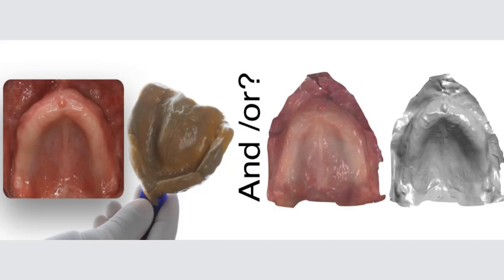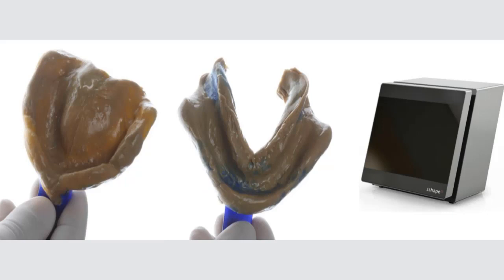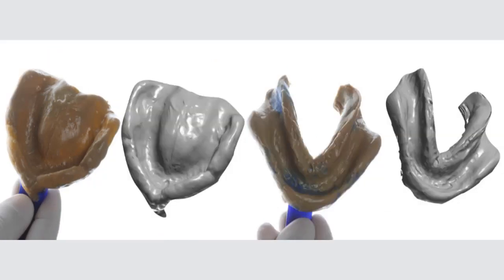Take an impression or scan it. So edentulous scanning is improving significantly, and here is one very nice scan that I have performed. This doesn't happen that often. Could be a little bit of doing more and more scanning and maybe some patches, which I don't like to do. So I would rather, for an edentulous patient for complete denture, when you are planning to place implants, take an impression and scan the impression.